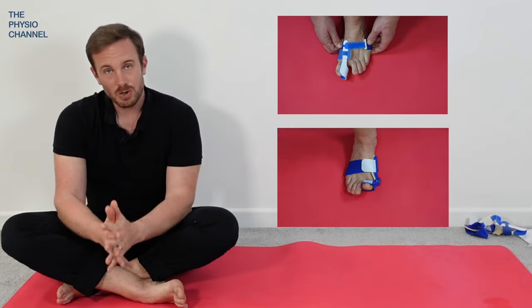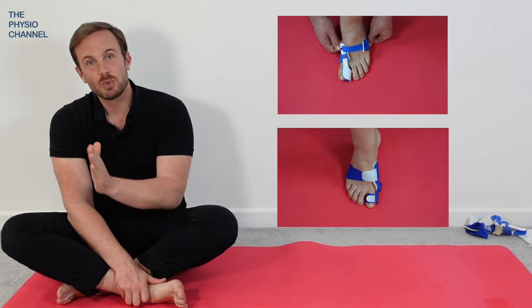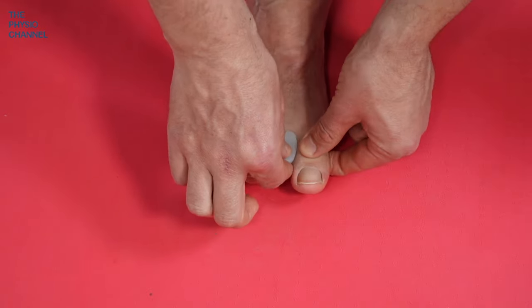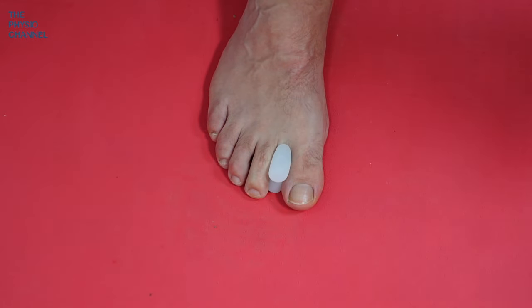The best combination seems to be one that you wear at night in combination with one that you can wear during the day. Even a toe spacer will count as something which can help to position the toe into a more comfortable position.